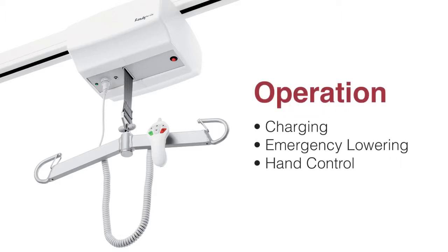In this section we will briefly review some of the operational features of the RITA including the charging, emergency lowering, and hand control.